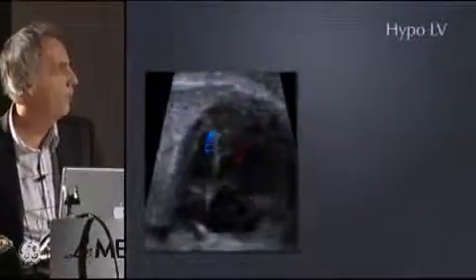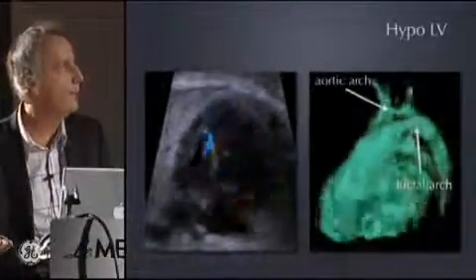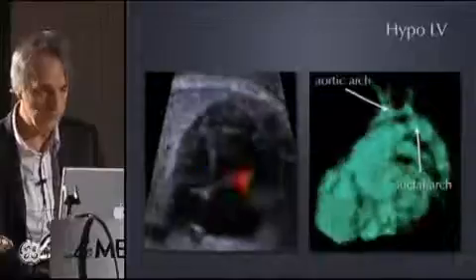And this was a hypoplasia of the left ventricle, and you can play also with the inversion mode to show it, but you don't really need the rendering mode. The best is to work with the TUI.